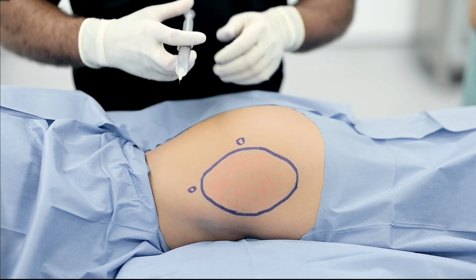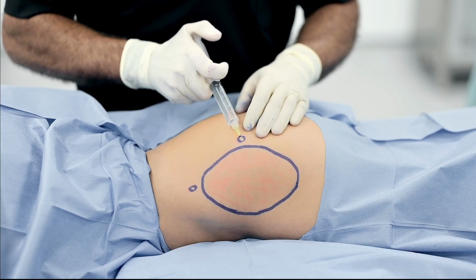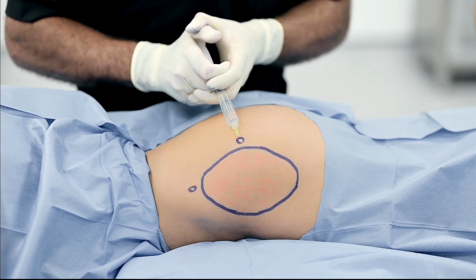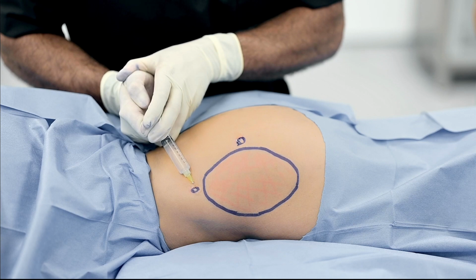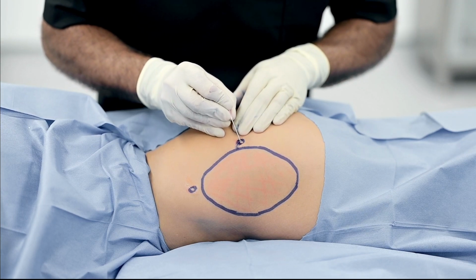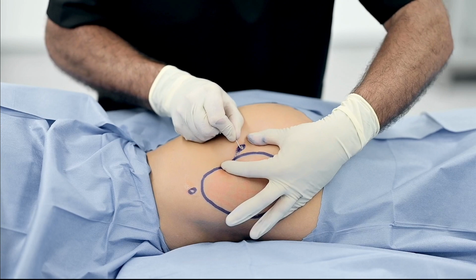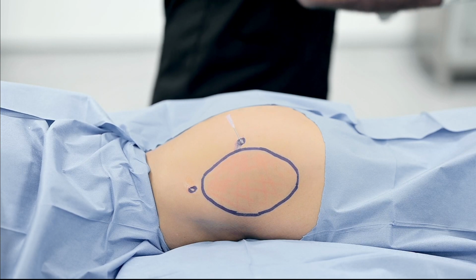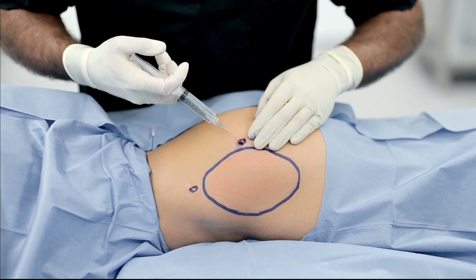Let's start with the anesthesia of the entry hole. Always the same, 30 gauge needle, xylocaine, lidocaine with adrenaline. 18 gauge needle. Lateral movement to open the dermis. Then additional anesthesia with a 22 gauge cannula.